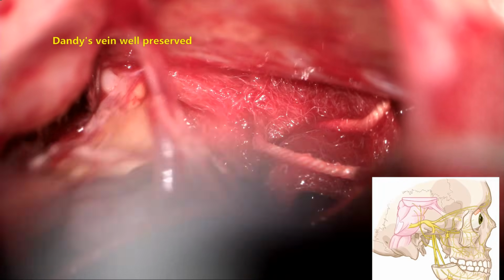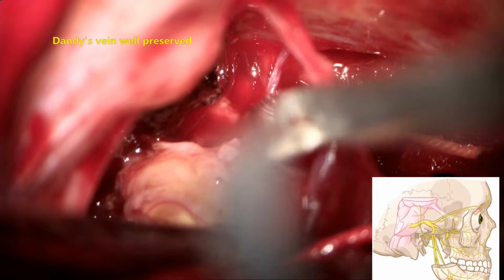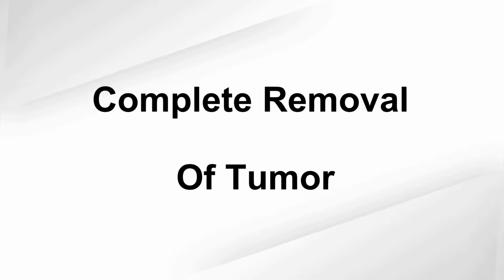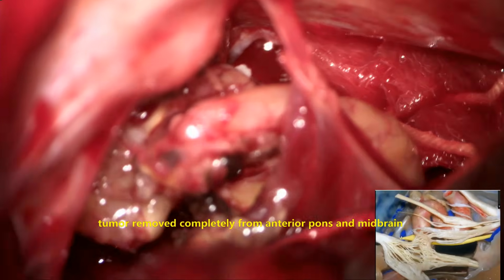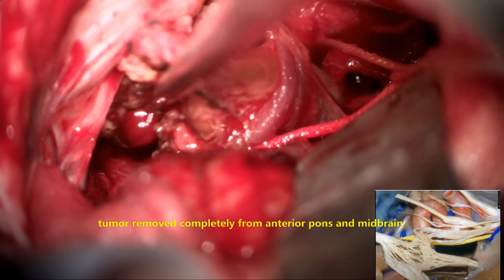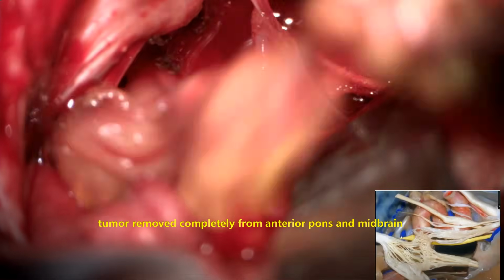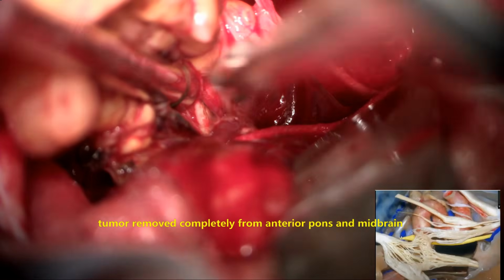Now, once that is separated, the superior part and the medialmost part below the tentorium cerebelli is dissected completely. That's an arachnoidal plane where the tumor is. Now, the tumor is totally separated from all around, superiorly, inferiorly, laterally, and medially, and the whole tumor capsule can be extracted in multiple pieces as shown here. This is the complete resection of the tumor.